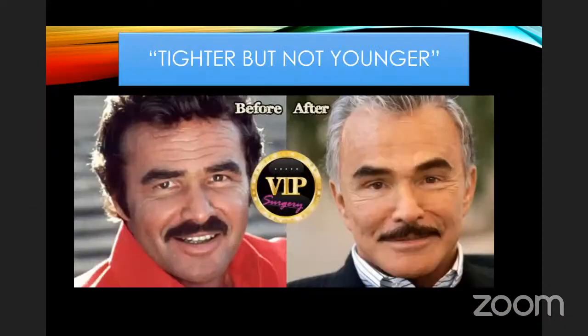So that previous slide was a good way to explain to patients why they need cheek augmentation. Now, when we do cosmetic surgery, it's really important to put something back, whether it's filler, whether it's implants, whether it's fat. And we know that by doing cosmetic surgery, sometimes patients are made to look tighter but not younger. And just pulling skin over a skeletonized face is not an aesthetic situation. We want them to look younger.